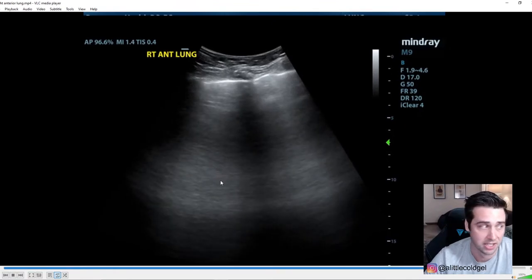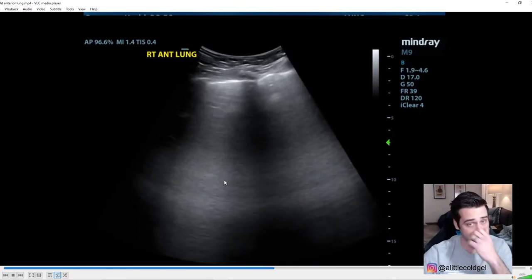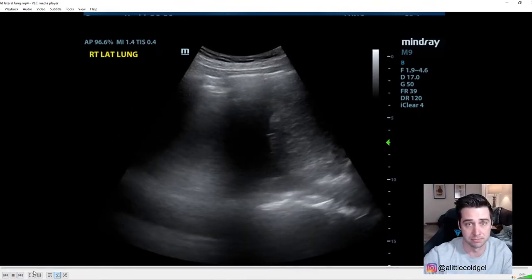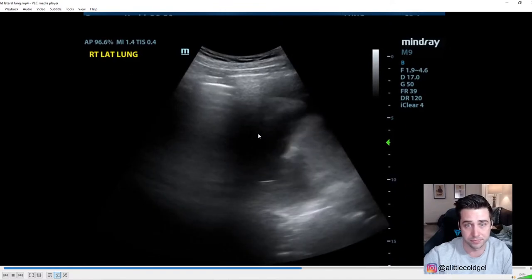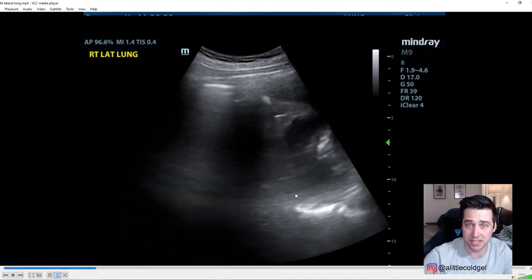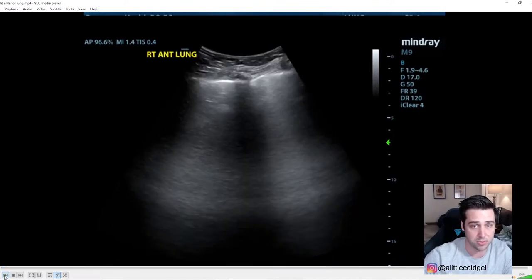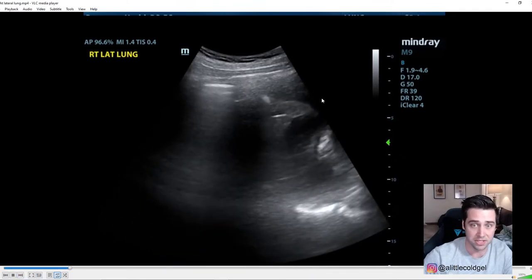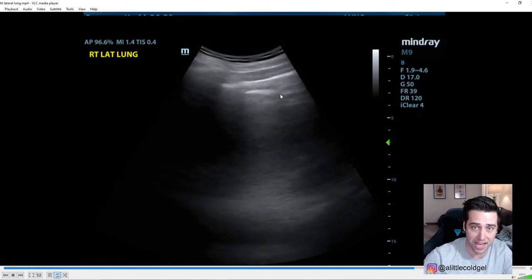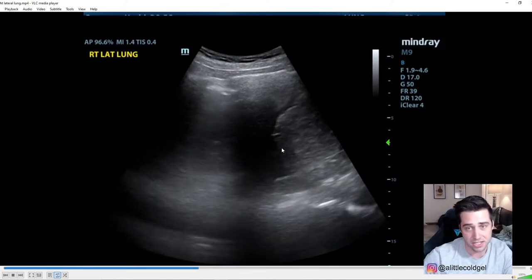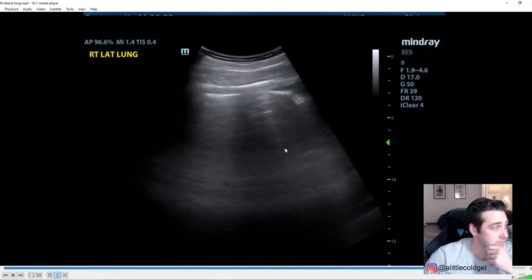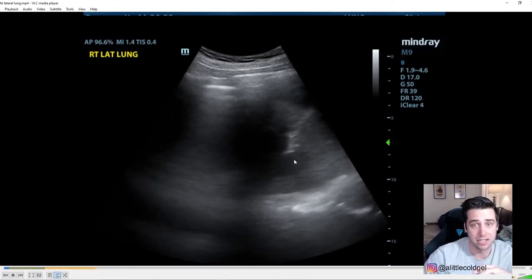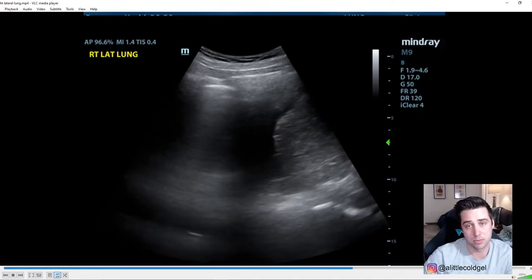You can also see the tip of the lung floating around in the effusion — with big effusions you can actually see lung flopping around. On this other side, we again see those spotlights from the pleural line — B-lines — consistent with pulmonary edema. Given that we had a heart with poor ejection fraction, we're suspecting this is pulmonary edema rather than pneumonia. And now this is the right lung — another effusion here, more subtle, with just a tiny area of black above the diaphragm and lung flipping in there.